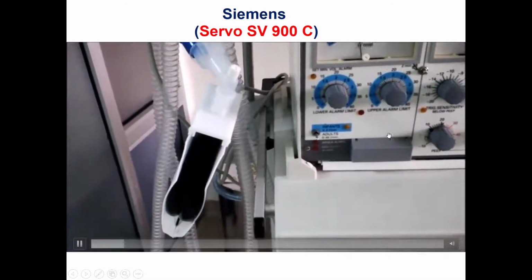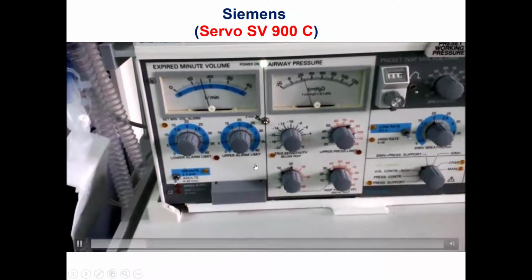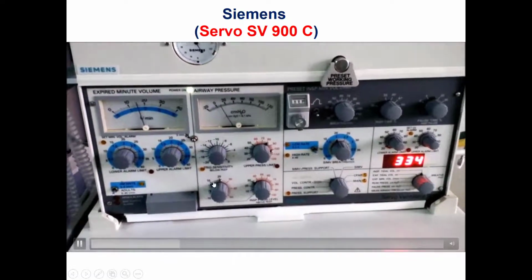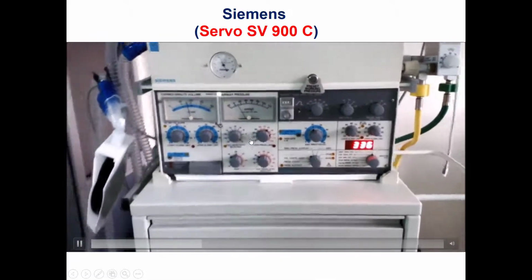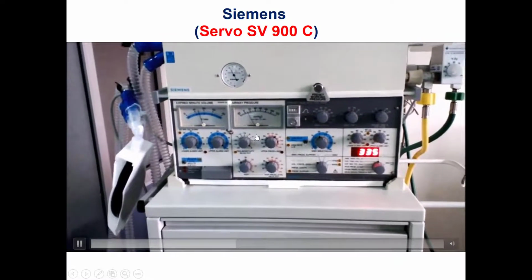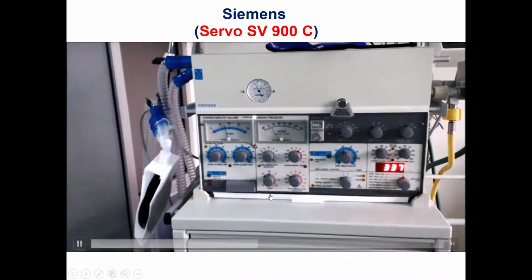This is the first generation, where the test and the calibration were done manually. We have a lot of potentiometers. I did one of the preventive maintenance procedures for such a device, for such a ventilator. It takes a lot of time. It should be done manually before the use of this ventilator on a patient.